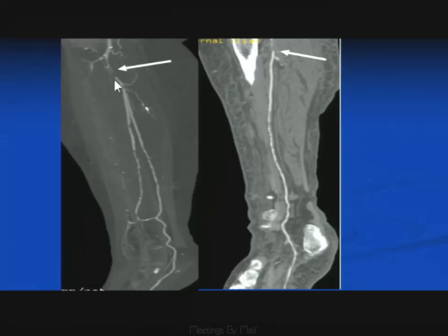Here's a case where we're demonstrating the circulation in the proximal calf, and this looks like the tibioperoneal vessel, which is focally out. And we've got some collateral circuit. We've got a single vessel, we've got two vessels coming down to the level of the distal calf. We've got some interconnection here between them. This is probably the posterior tibial and the peroneal.